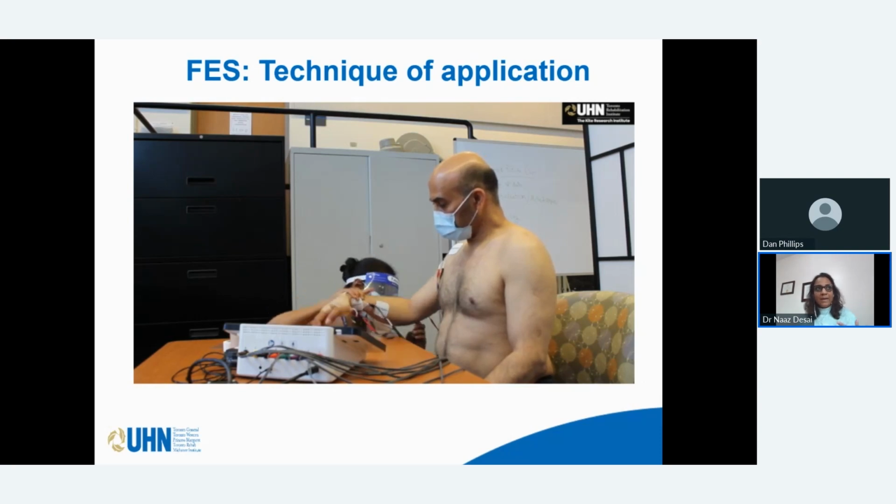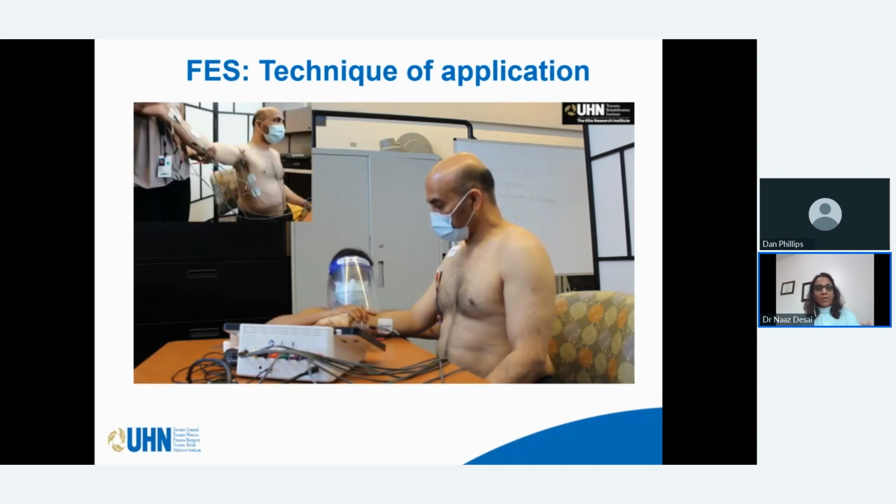So we have this feedback that is the current good enough for the task that we are training. But for certain other muscle groups, like for example, the serratus anterior or the lower trapezius muscle, there might not be an obvious movement. So palpation plays a huge role. So we typically palpate for the muscle that we're setting up.